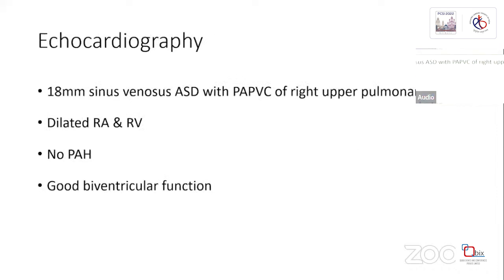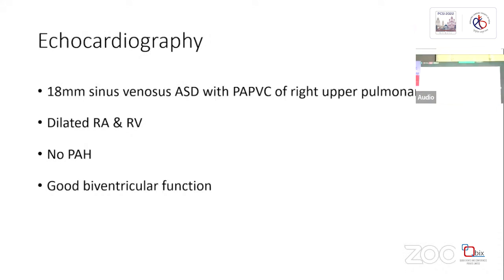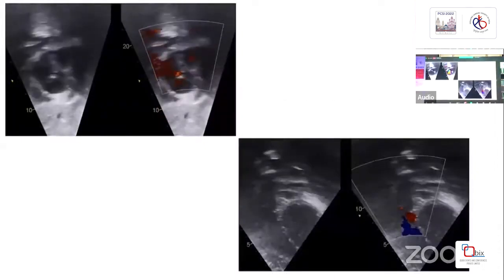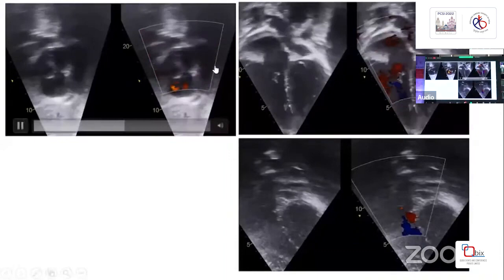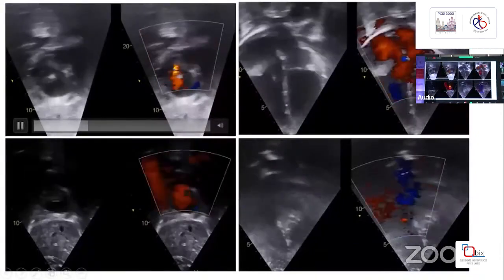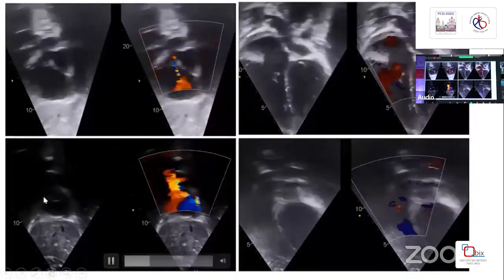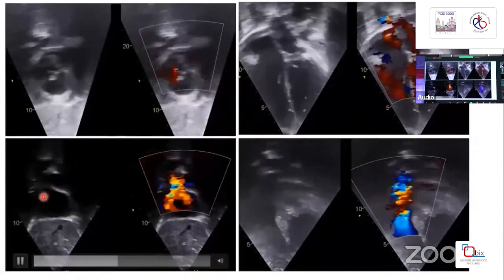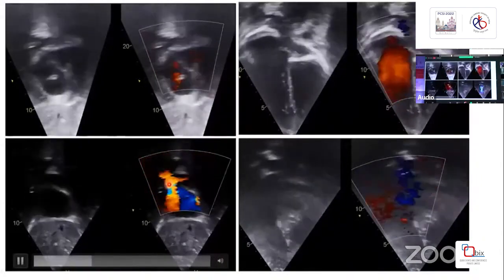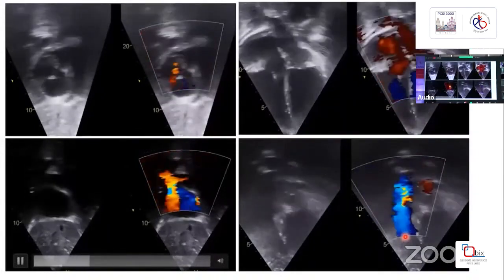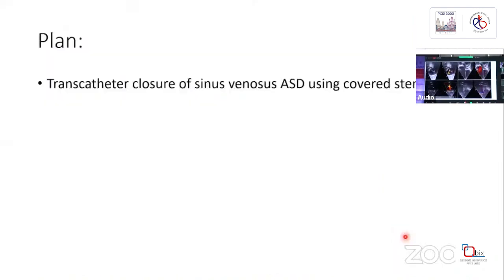Echocardiography confirmed an 18 mm sinus venosus ASD with partial anomalous pulmonary venous drainage of the right upper pulmonary vein, dilated RA and RV, no pulmonary arterial hypertension, and good ventricular function. On subcostal imaging, you can see the large sinus venosus ASD with two streams of flow — one from the SVC and another from the right upper pulmonary vein. There is no pulmonary stenosis and no pulmonary arterial hypertension. We are planning transcatheter closure of the sinus venosus ASD using a covered stent.